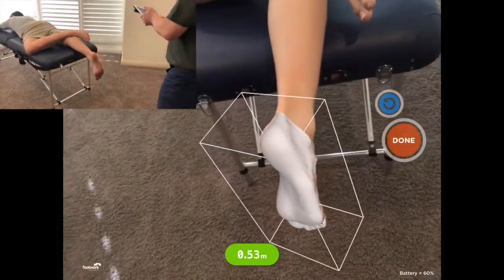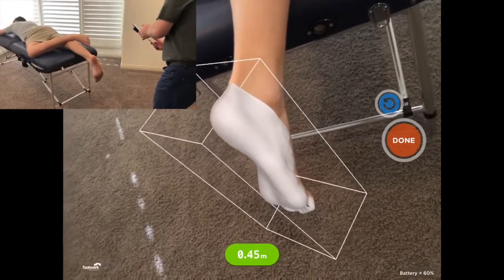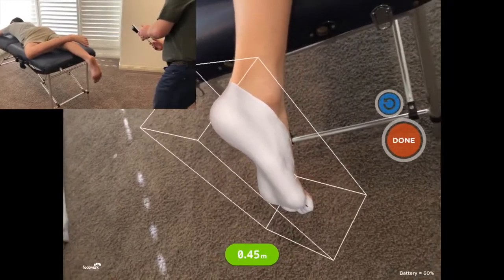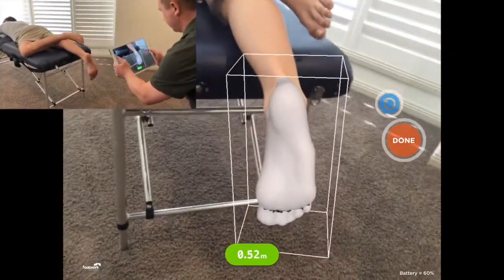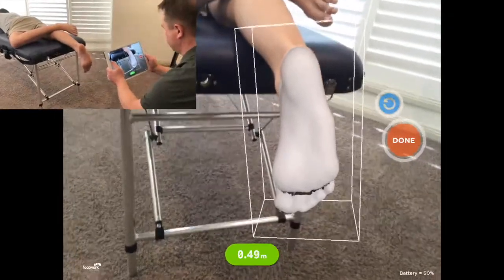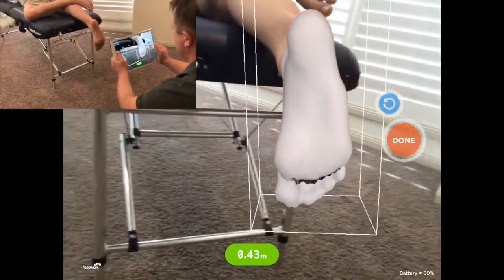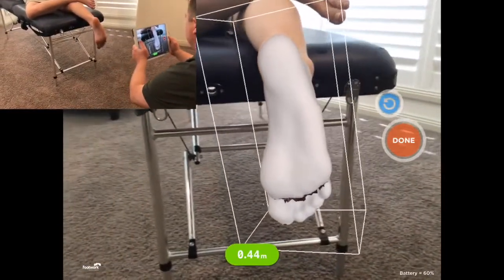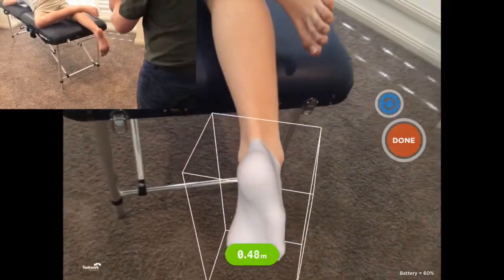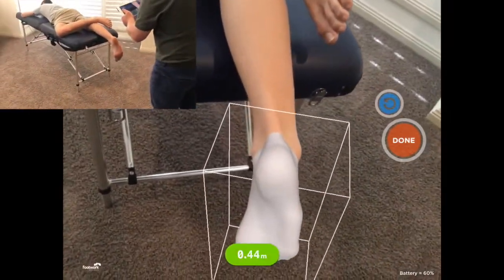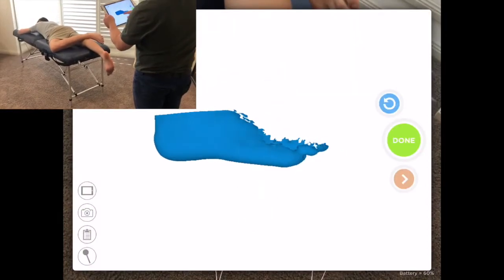Again, like with the previous version, you go around slowly and smoothly, keeping an eye on the green distance bar — make sure it stays in green as much as you can. Go around the areas at least twice to make sure you've got a nice smooth finish. It's kind of like spray painting. You then check your scan, make sure everything appears as it should, and there you go.